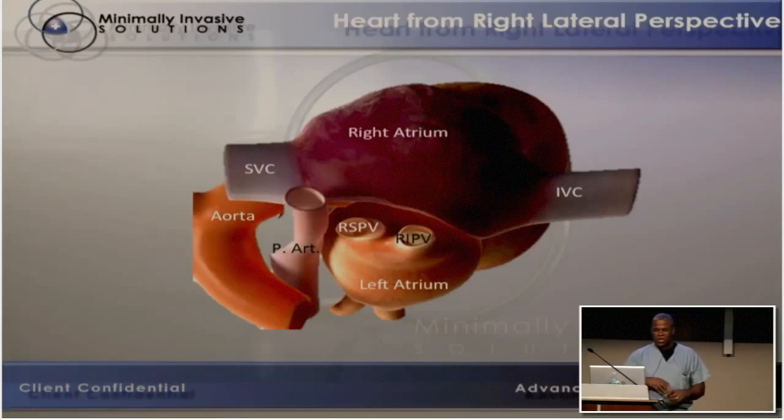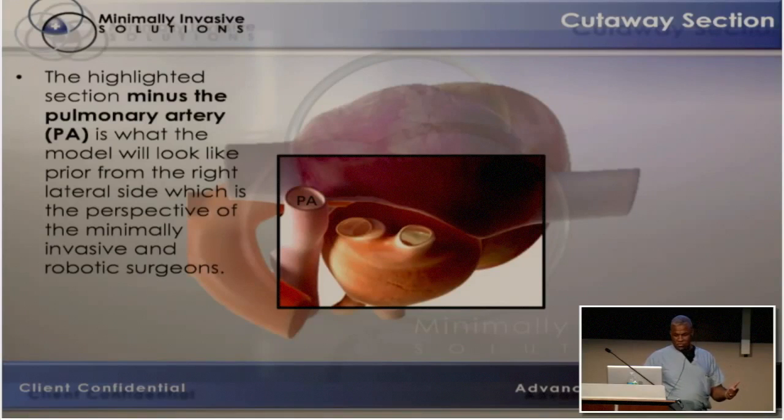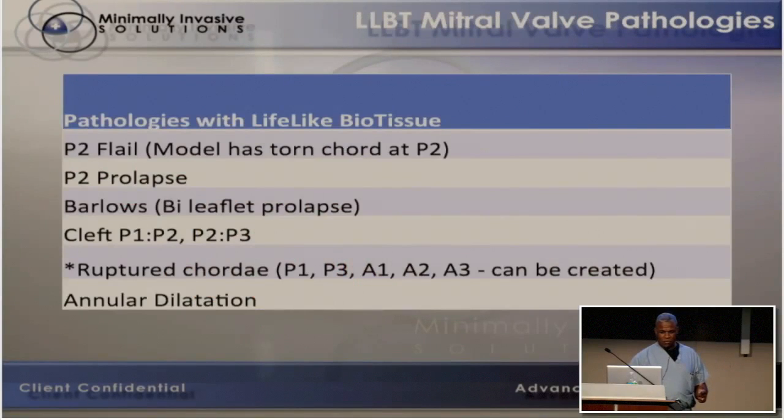Then we took a look at the anatomy. So what does a typical anatomy look like? We had to identify where the anatomy is located and then determine how would we get to it, and then from there figure out, well, what shape is it going to be in when we get access to it so that we can create something that's anatomically correct. And so we started with the real-life model. The next thing that we did was we wanted to highlight certain parts of the anatomy that we would not necessarily need to model right up front because, number one, it might take too long or cost may be an issue. Because remember, we're trying to go back and fix these problems.